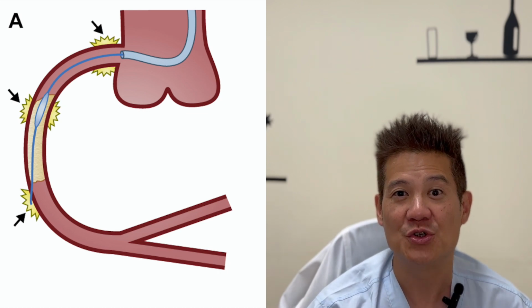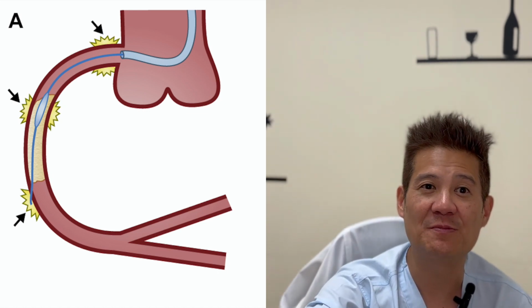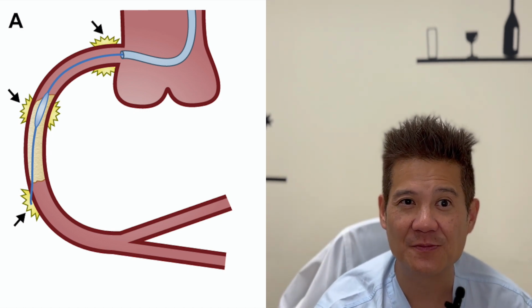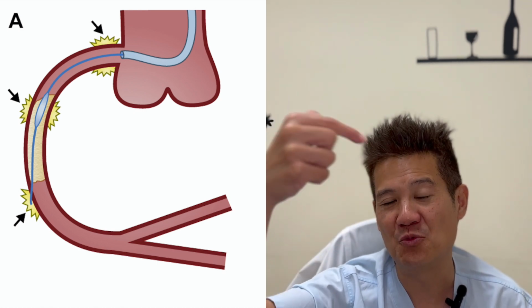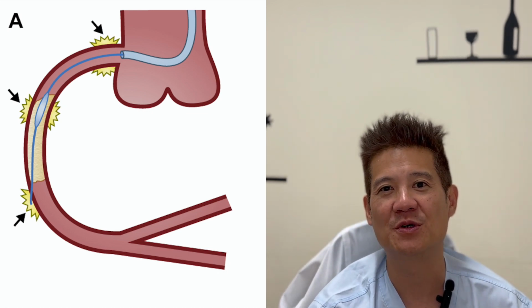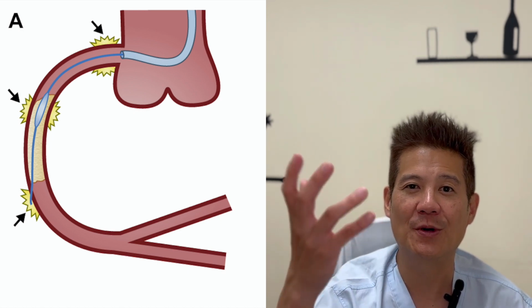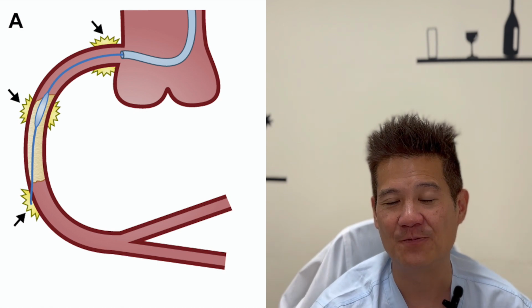Another way to make a connection is wires. So if a wire goes from the true lumen into the subintimal space, that is the connection between the true lumen and the extraplaque space. Usually, if we just wire into the subintimal space and we pull it back and rewire the true lumen, that's not a problem because that's only a very small hole, a 0.014 hole between the true lumen and extraplaque space. And even if we pressurize it, usually that's not going to cause a hematoma expansion.